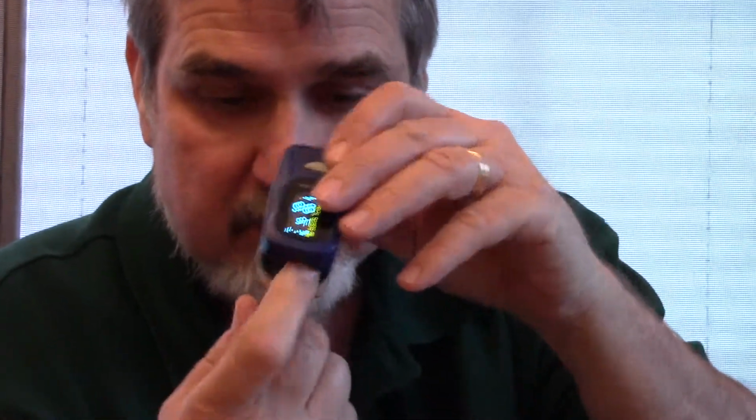Let me show you what happens when the pulse is not reliable. I'm going to place it on my small finger. And again, this is for people who are over 4 years of age. Now, that's regular. Boop, boop, boop, boop. Now it's skipping. So that means it's not regular, and that means you're not getting a reliable reading. You've got to try again. Always use the index finger and put it all the way in.